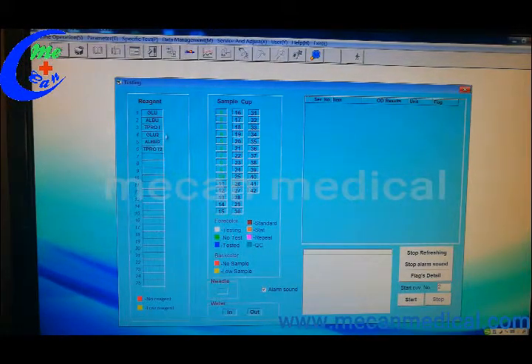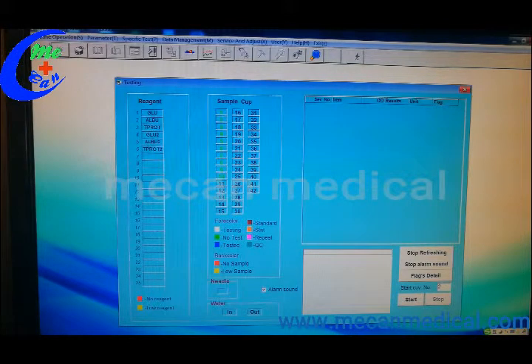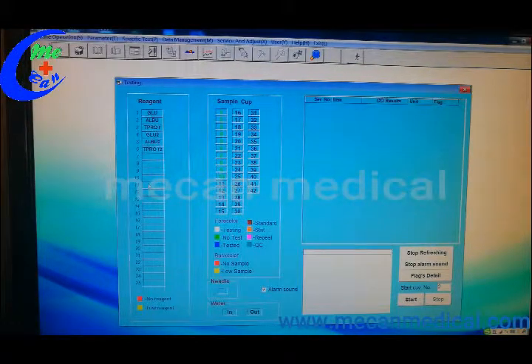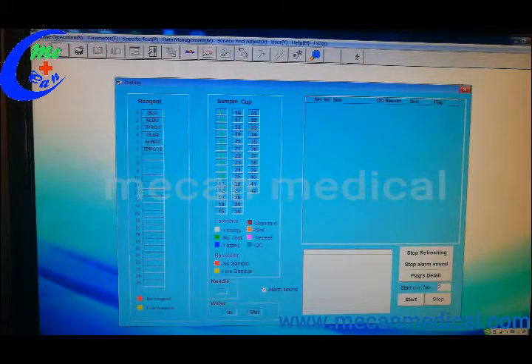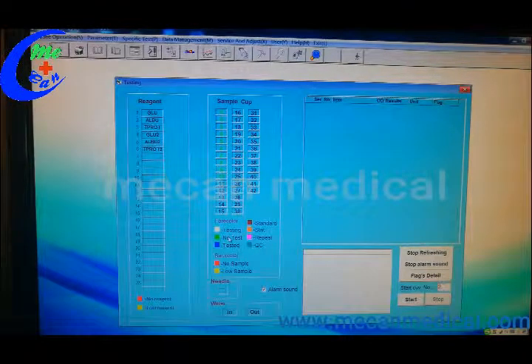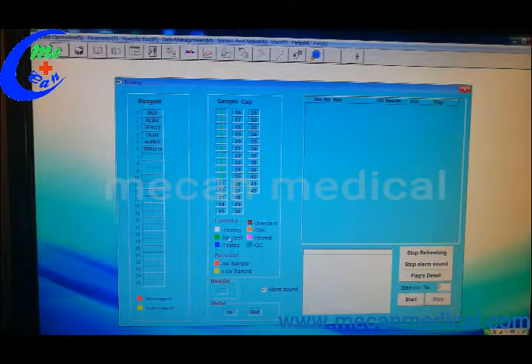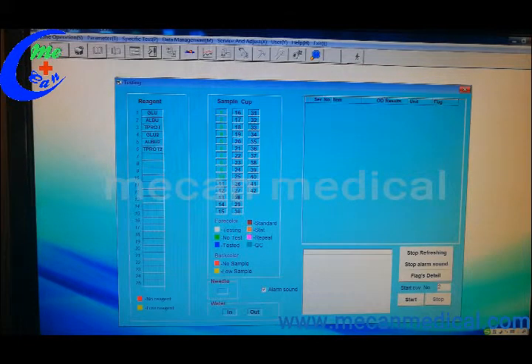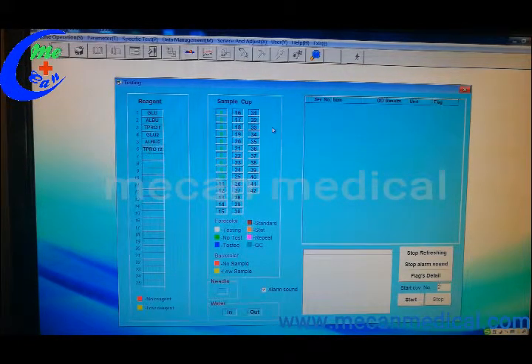The reagent volume will show here. This is the color which shows the reagent and sample status.